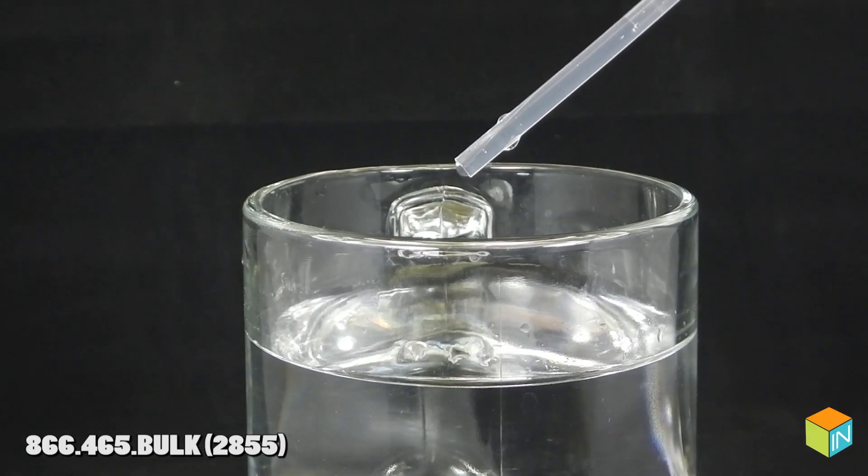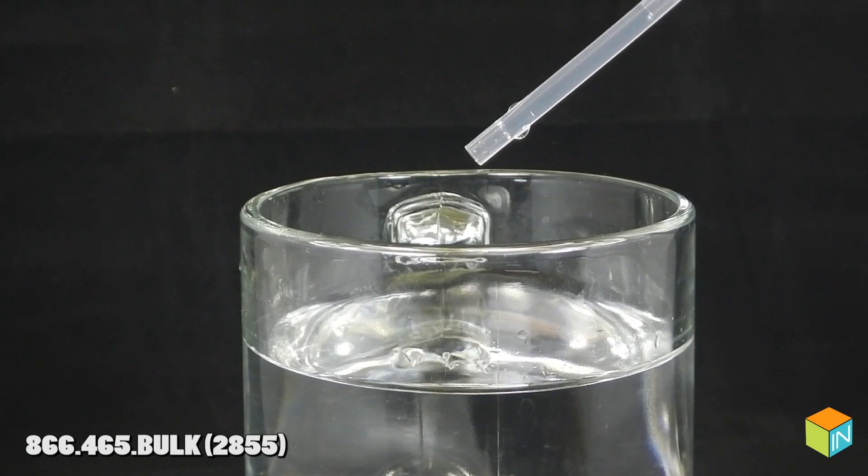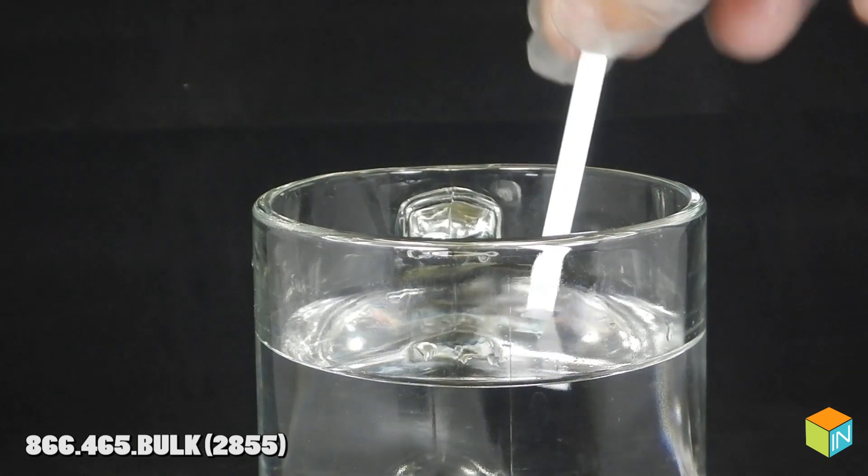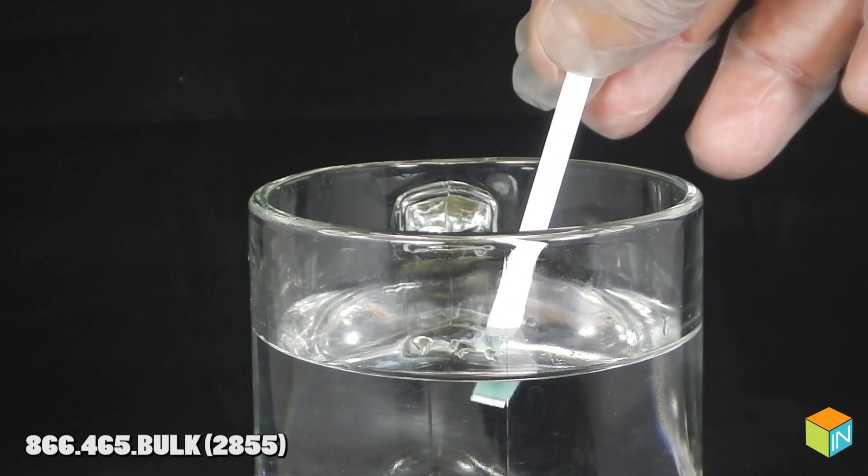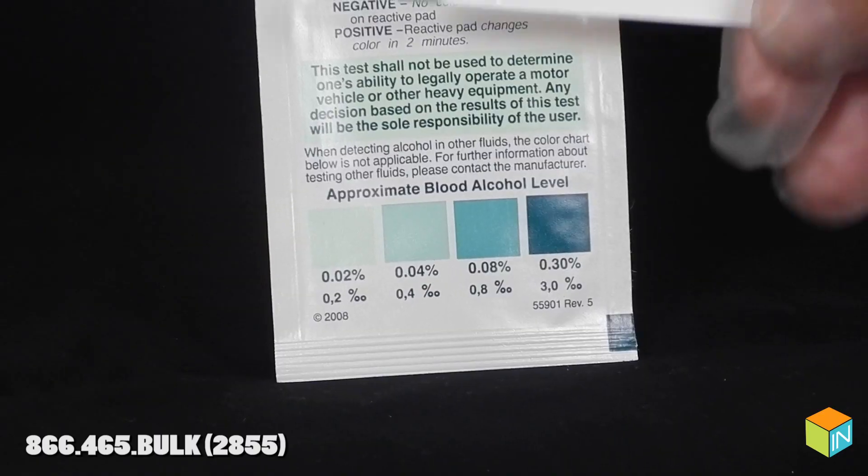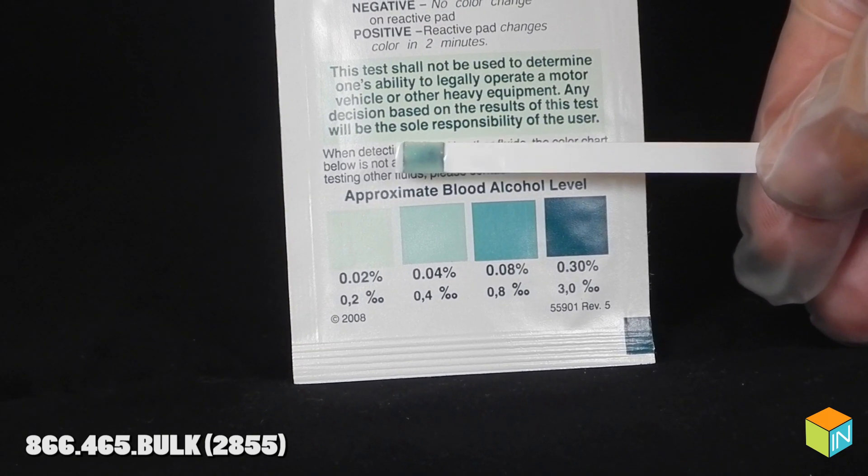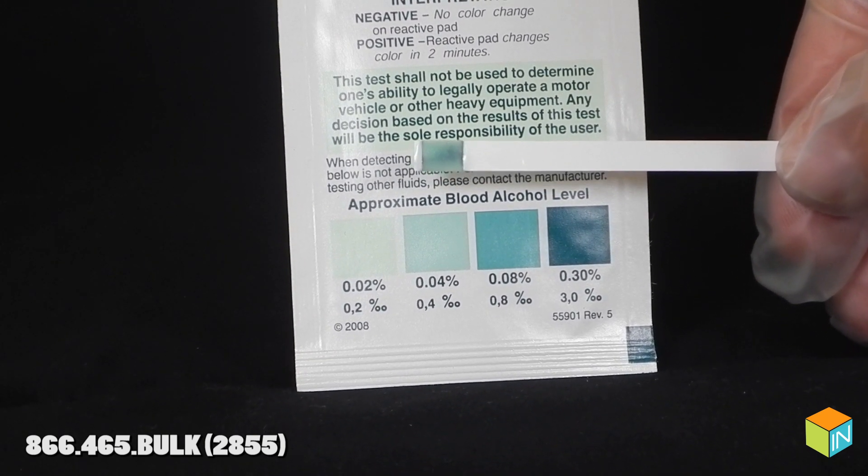For a quality check, proper performance of AlcoScreen can be confirmed by testing a mixture of 4 drops of 80 proof distilled spirits in 1 cup of water. The results should be equal or higher than the 0.04% color block.